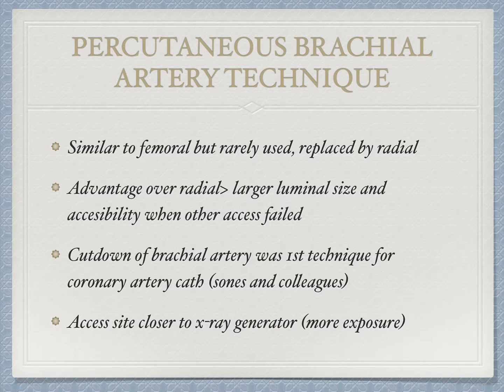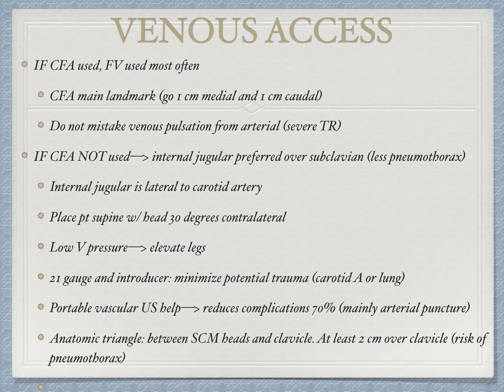Now, the percutaneous brachial artery technique, use it if you cannot use the other techniques, but this one has the problem that it's similar. It has been replaced by radial and expertise has diminished for most operators. Now we're moving on to venous access.